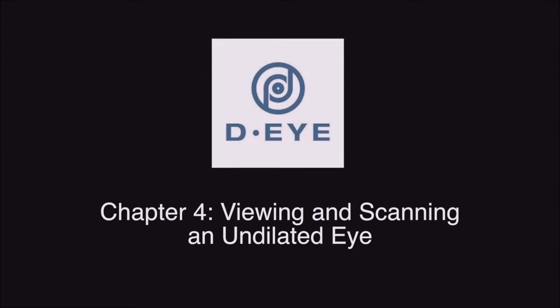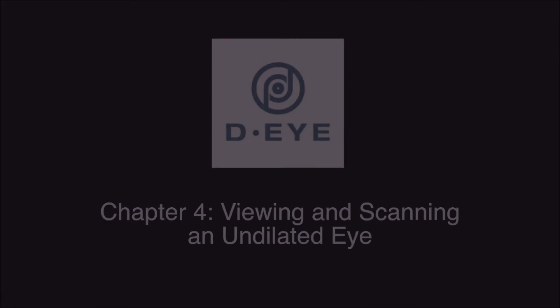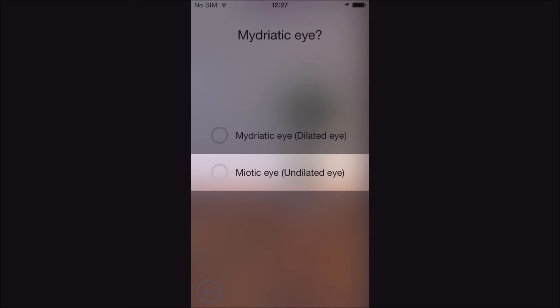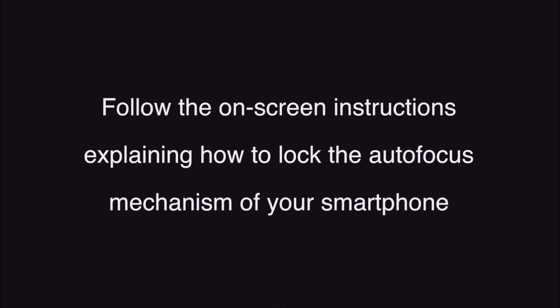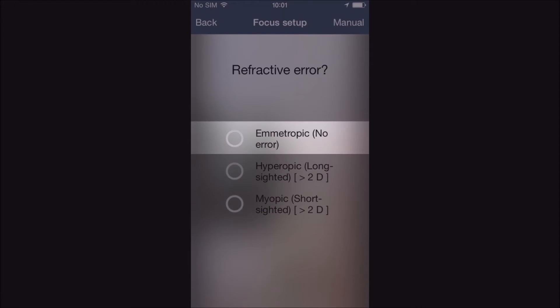Chapter 4: Viewing and Scanning an Undilated Eye. Choose the myotic eye option, where you will see three choices depending on the refractive error of your patient. There are on-screen instructions explaining how to lock the autofocus mechanism of your smartphone for all three choices prior to conducting a retinal exam. In this chapter, we will discuss what to do when examining the emetropic eye.